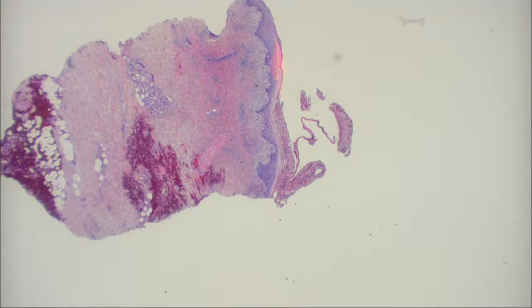You know, before I was a resident, Dr. Ackerman actually used to take his fellows and residents to the art museum. There's a nice art museum in New York, the New York Metropolitan. He said, let's just look at colors in paintings. It's a good practice to do because you can just see the main change here is color alteration. What do we have here? A pallor. Yeah, pallor. Good. We've got normal, maybe a slight acanthosis here, but this is more blue, purple, and this is pale and white.